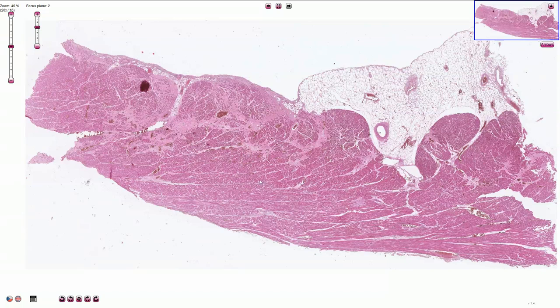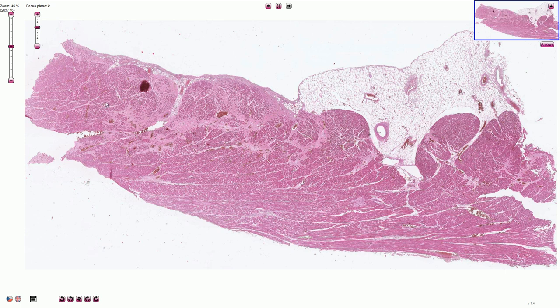Here we can see a part of the myocardium with epicardium and some epicardial adipose tissue in the external surface of the heart. This myocardium is associated with dispersed myocardial fibrosis. Some small amount of fibrous tissue around blood vessels is physiologic, however this area here is definitely abnormal.